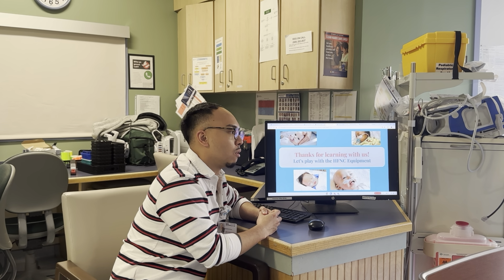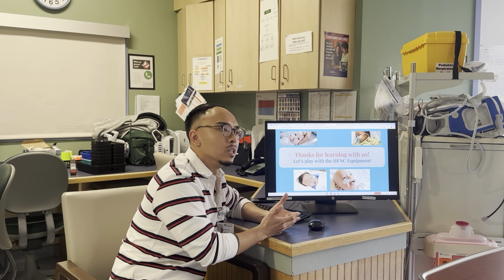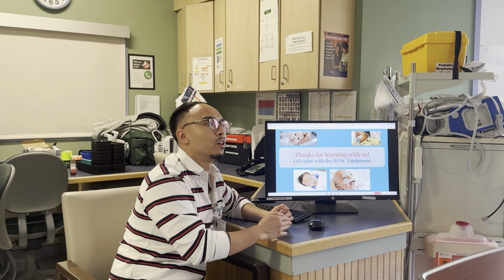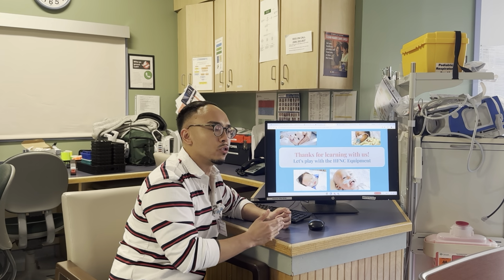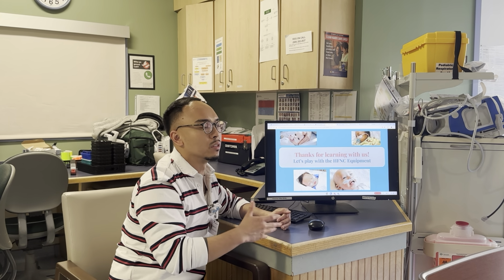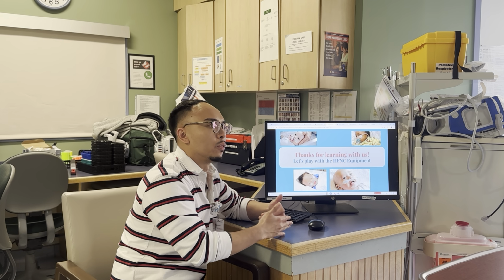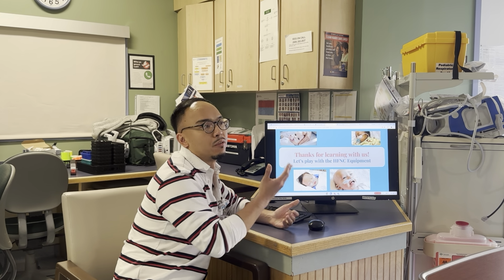But as a general tip, when a patient comes in with high flow needs, they usually should be on the stable end anyway, so I hope it doesn't instill any kind of fear, it's just a higher level of oxygen that they need. It's more your assessment skills that you want to brush up on to see if they escalate in terms of their needs, then you have a means of communicating to the team, and this is a tool so that you don't have to stay quiet about that. You could say at this huddle, at the 1 hour, at the 1.5 hour mark, I have this tool to communicate and advocate for my patient.